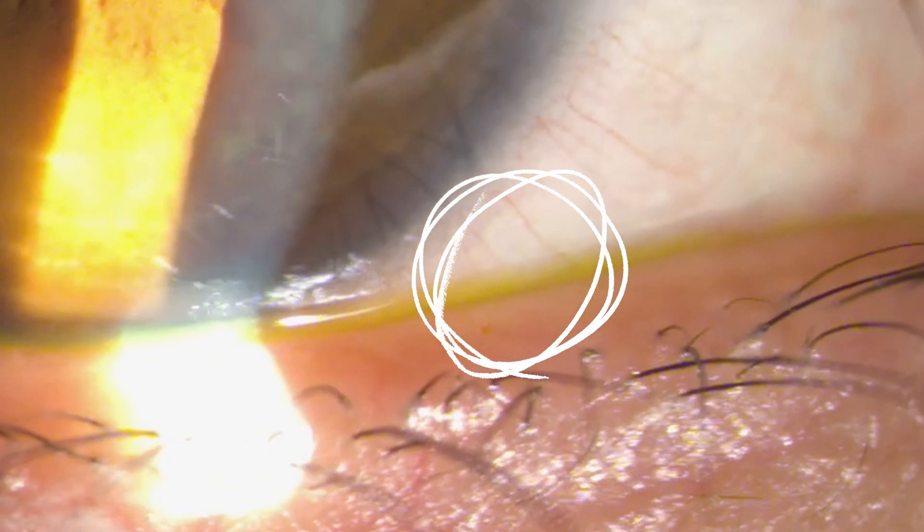So the patient has had fluorescein and stain into the eye, and that's why you can see a little bit of a yellow hint of the tear film.